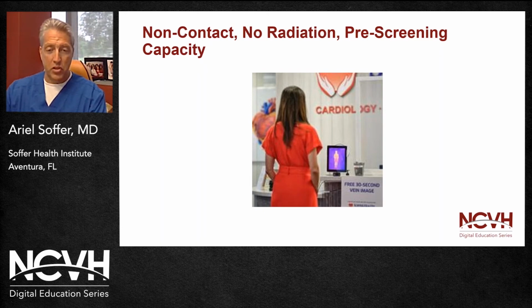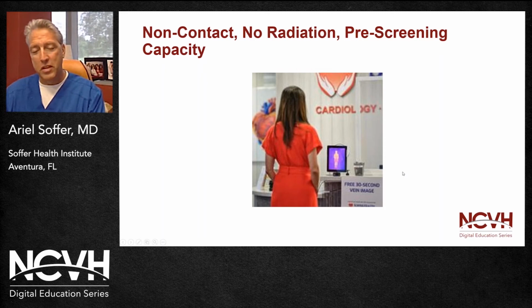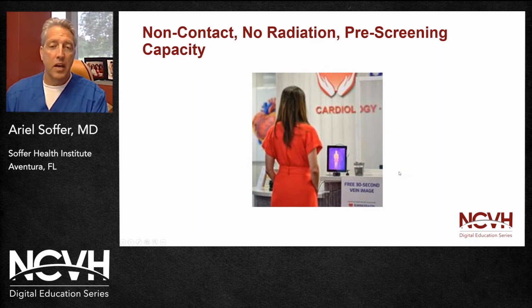We're capturing just the temperature radiation that's coming off of the human. And it's been a nice thing for pre-screening. This is someone coming into one of our offices. We use it in this case just illustratively. We're just drawing attention to it right now, as we've not commercialized this, but it was an interesting thing that we added to some of our offices with just a lot of interest.